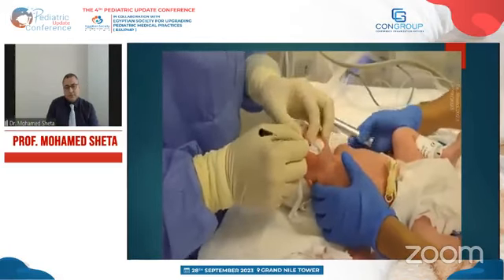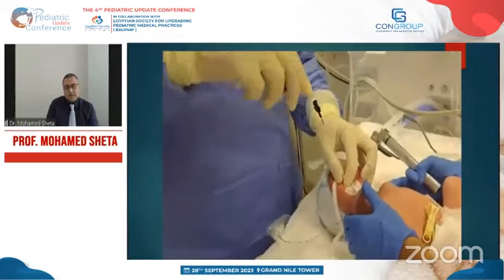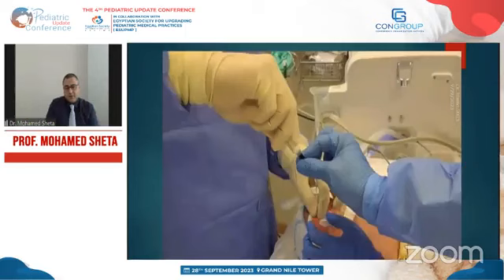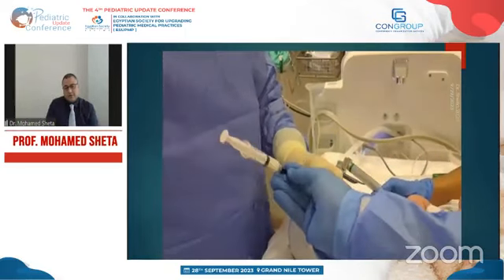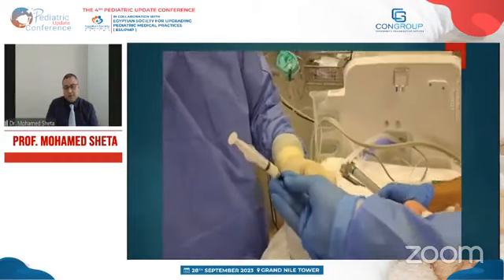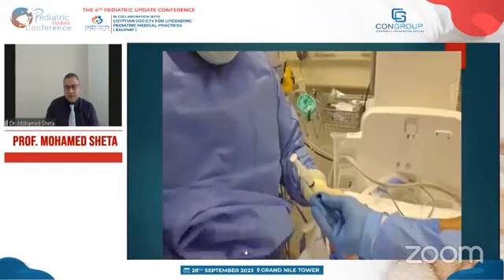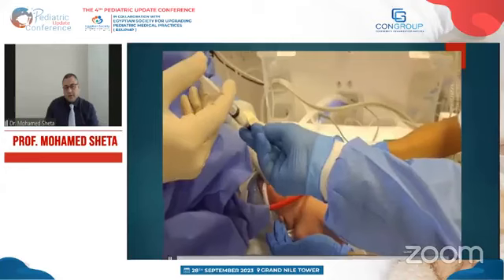I will fix the tube, and we'll take the surfactant while we are monitoring the baby. Some babies will have tachycardia, some will have some bradycardia, some temporary desaturations, but it will be managed.